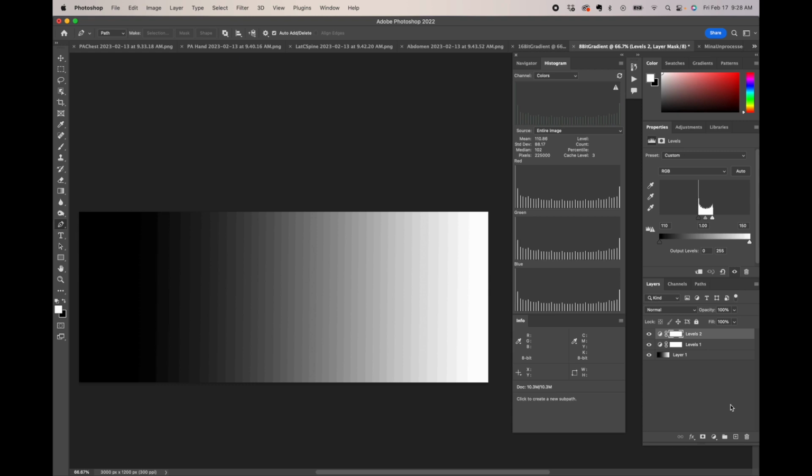I won't get into that, but basically with exposure index value, if you haven't noticed yet, it could be vastly different from one type of machine or one vendor to the other, one clinical site to the other. So it's important to learn that value because we can look at it and also the histograms and know how accurate our x-ray is that we're giving the radiologist, and whether that machine has had to do so much adjustment that the radiologist isn't getting diagnostic information that they need.